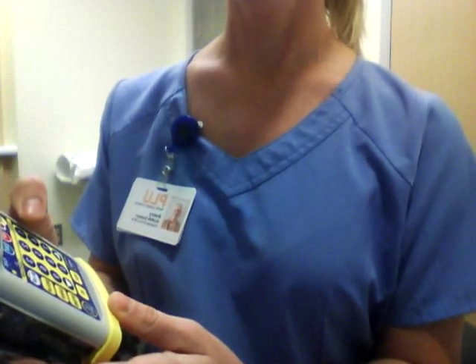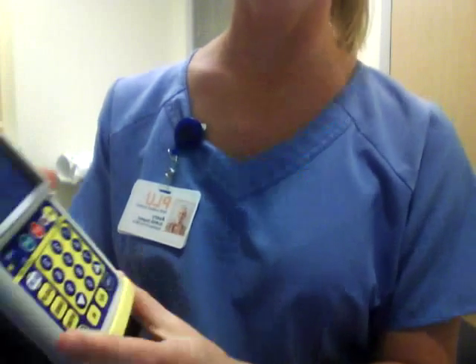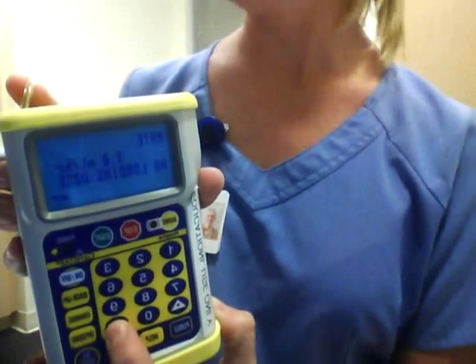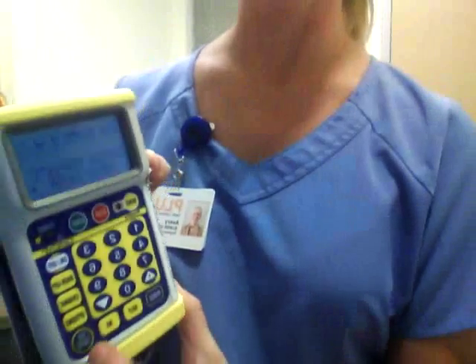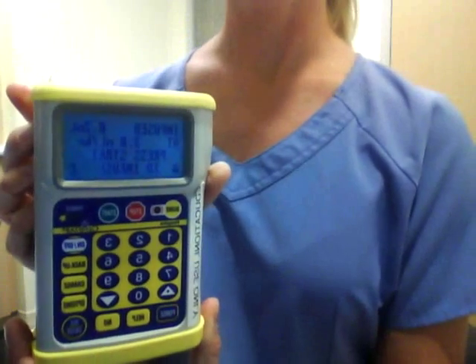You'll want to resume the program, and this will allow you to review the program. You use the arrows up and down to scroll through and review. Then 'review complete' asks, and you can press enter. And then you're ready to start your infusion.